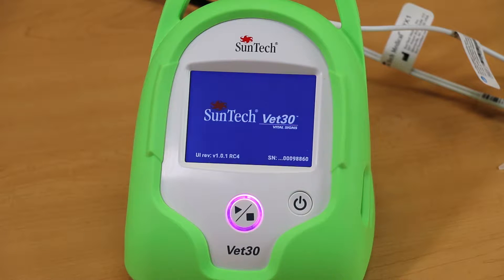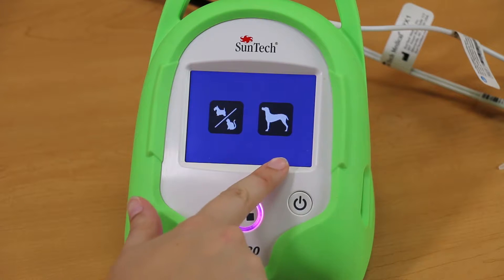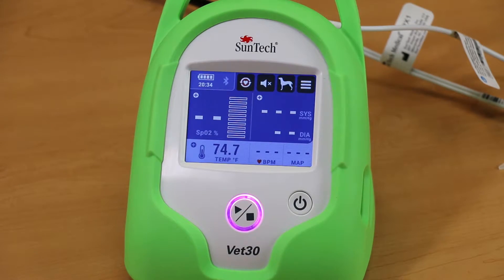Small animal mode should be chosen when taking BP measurements on cats and dogs up to a number 3 cuff size. Large animal mode has been designed for animals requiring a number 4 BP cuff or larger.